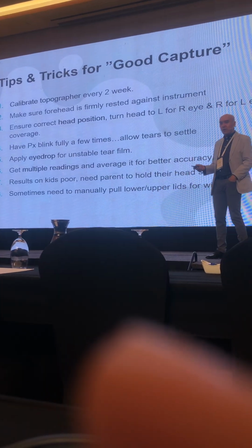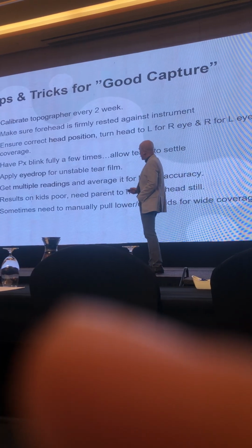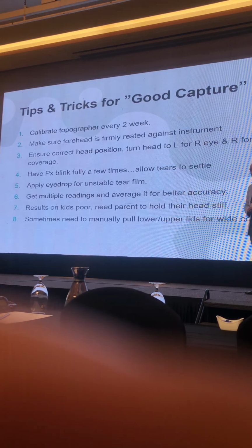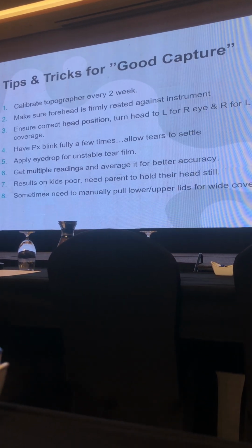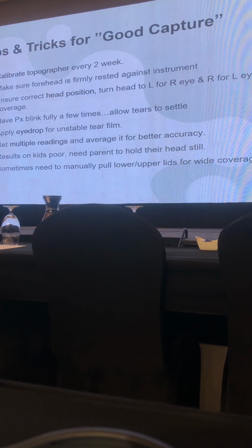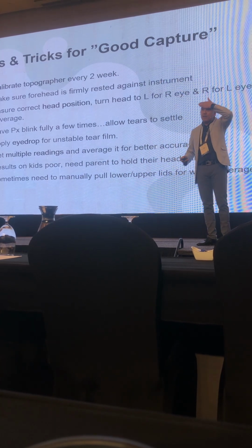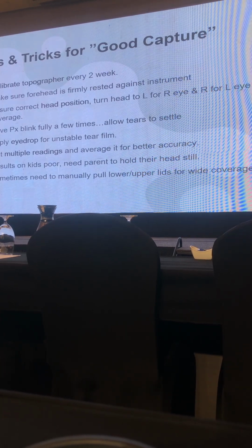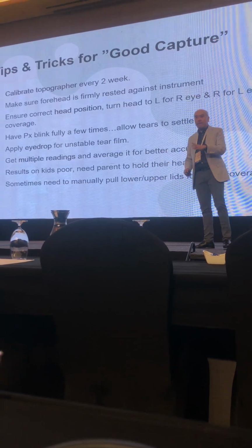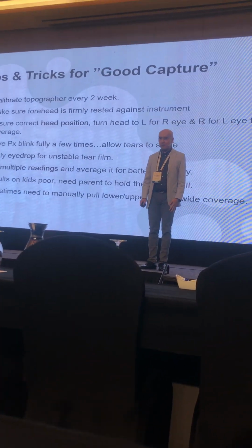So each time you ask your technicians, or yourself, to do the capturing from your topographers, there are a few things you need to remember. Calibrate your topographers every 2 weeks. Then, when you place the forehead, make sure the patient's forehead rests against the band here. For those who have a nice high nose bridge, ask your patient to tilt the head.